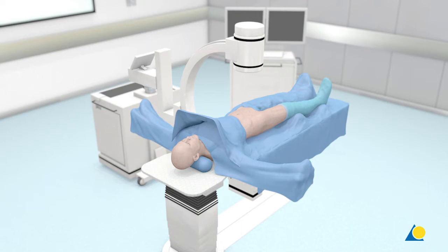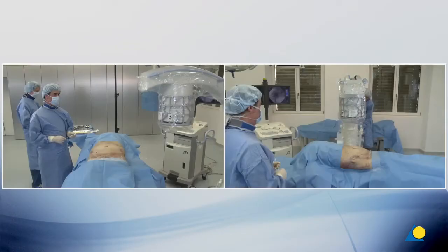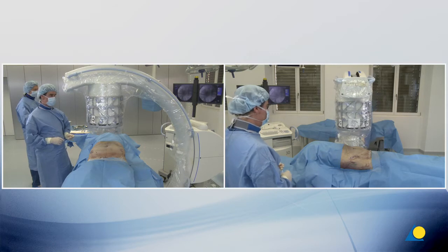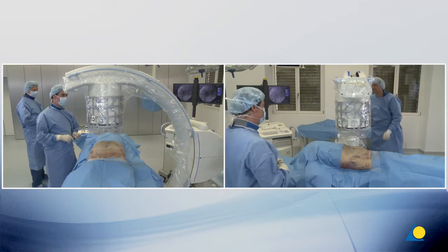The patient is prepped and draped so that the involved side is available down to the OR table. The involved leg may be free draped to allow for traction and manipulation if a closed reduction is necessary. The sterile draped C-arm is brought in from the uninjured side and placed in the outlet position.